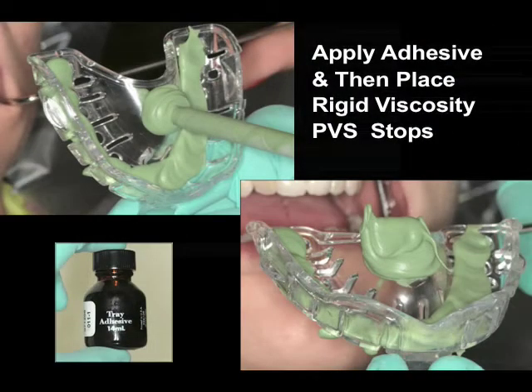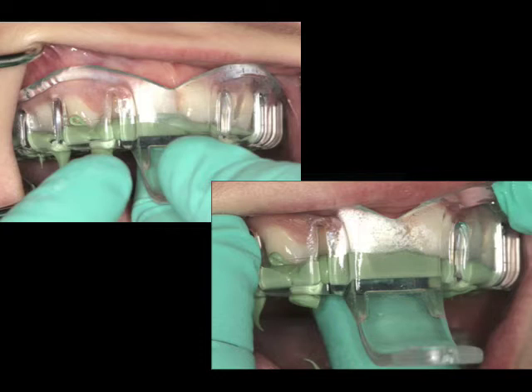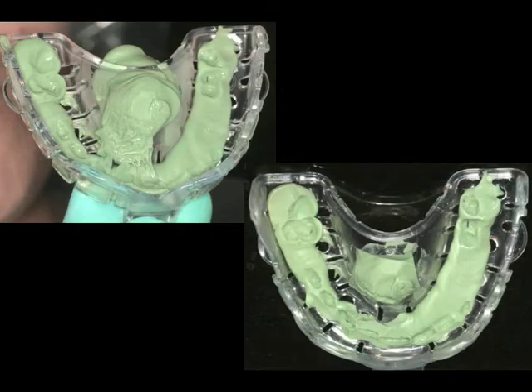Once the tray is shaped for the mouth, we must apply some adhesive into the tooth channel area and on the palatal surface. Once this has been done, we take a rigid polyvinyl siloxane material. We put a ribbon of material all around the tooth channel and then fill up the palatal area. We now slowly place this in the patient's mouth, making sure there's enough space between both the buccal, labial, and lingual surfaces of the teeth. We have now removed it from the mouth and there are tooth indentations and axial walls. Trim this area so that there is no axial height to the indentation, but only stops.